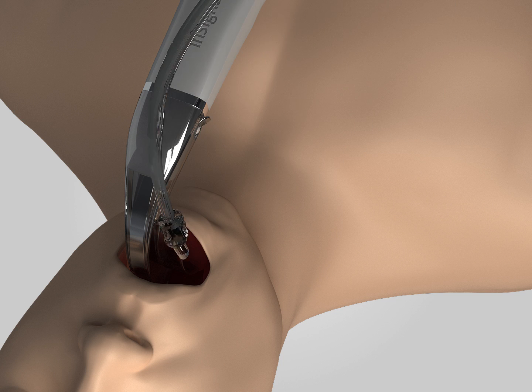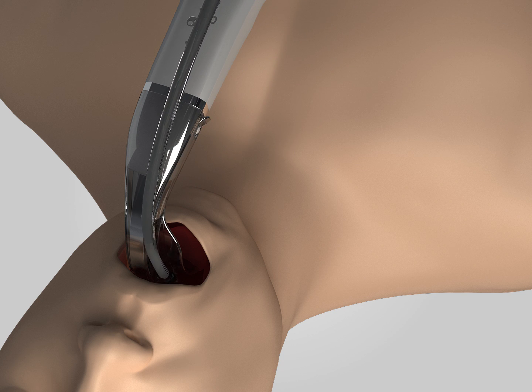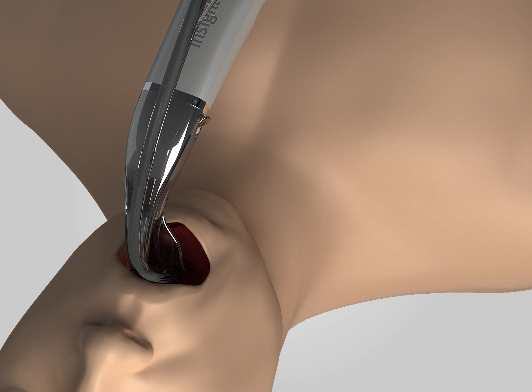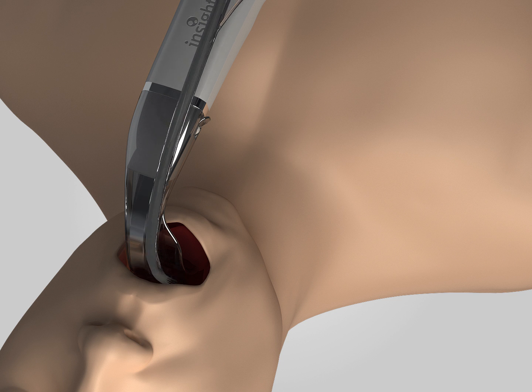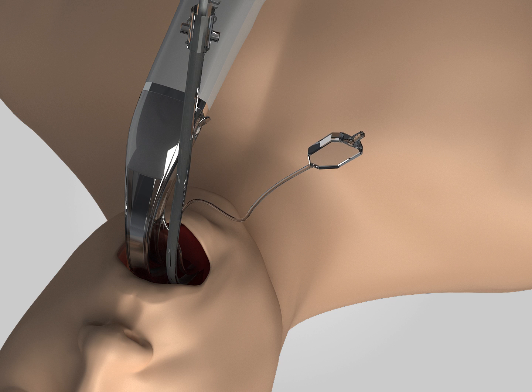Looking straight at the patient's oral cavity, insert the bending part of the front end of the tracheal tube into the patient's mouth from the right side and in the direction perpendicular to the long axis of the body. Rotate the tube 90 degrees counterclockwise and erect the tube toward the operator.